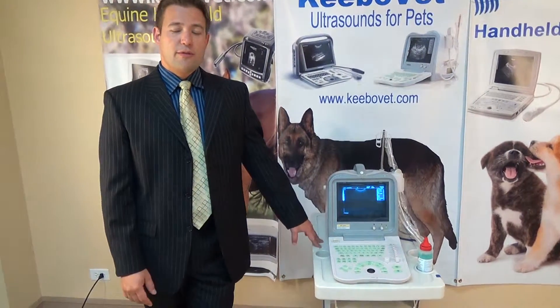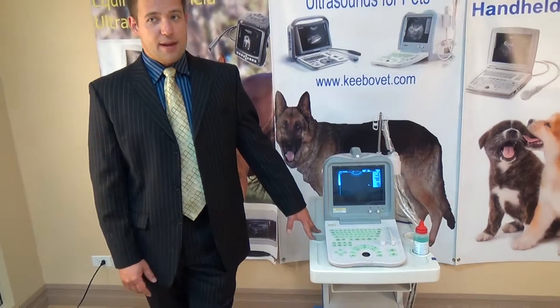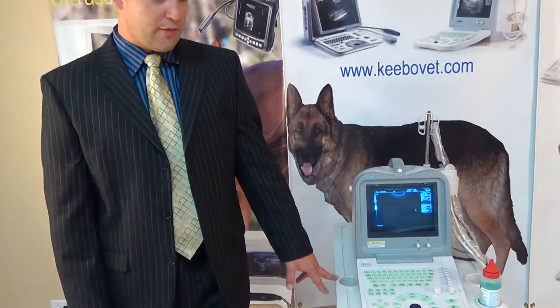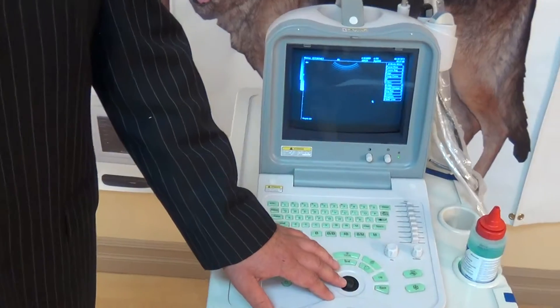My name is Theo and this is part 2 of 3 for KiboMed's display of the model KX2600KV ultrasound machine. For this part we're going to go over some more of the features of the keyboard, so come on in and take a look — we're going to start off with the area right above the trackball.